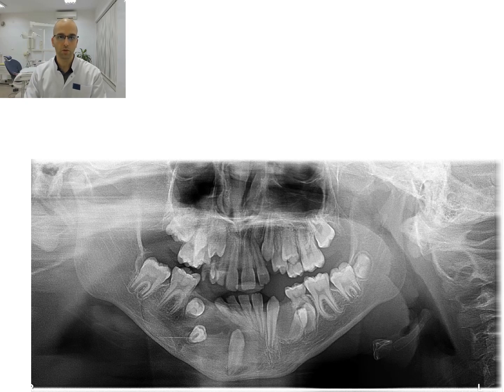This panoramic X-ray reveals the result of the decompression and depicts the initial healing process. The size of the cyst is reduced. The position of the lower canine has improved substantially, but now it is in very close proximity to the root of the lateral incisor.